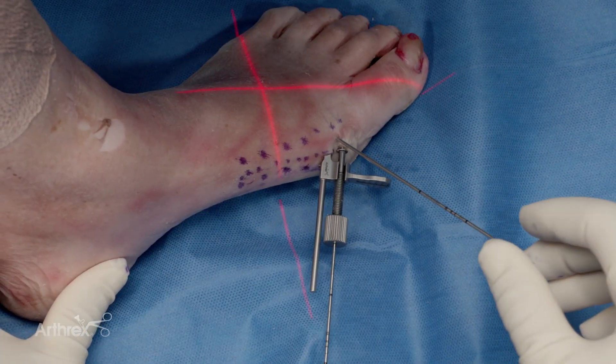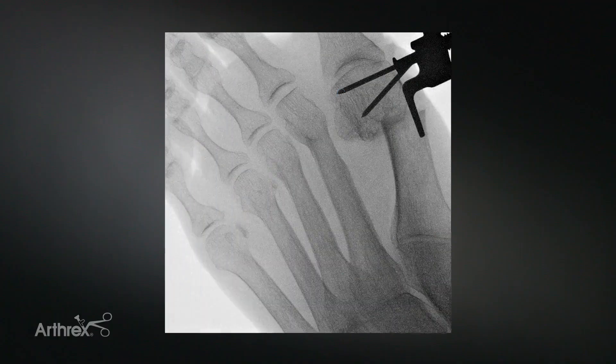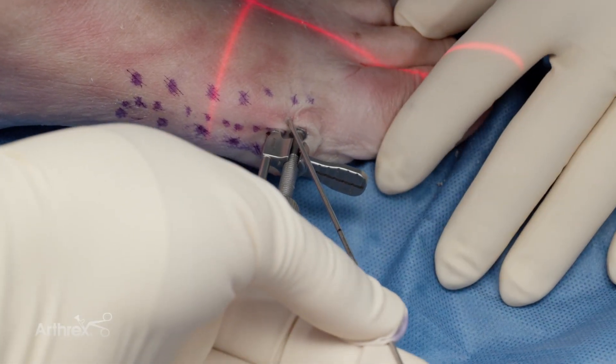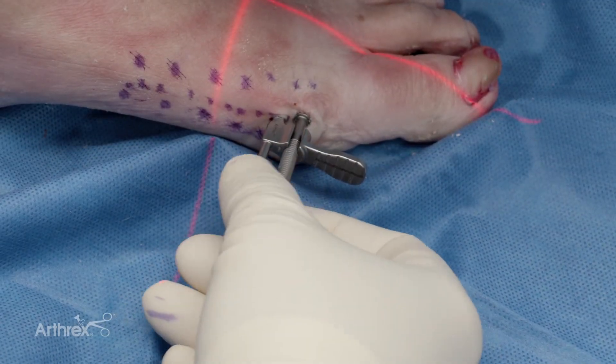If you need another point of fixation or really want to supinate the toe, you can put another wire off-axis and simply supinate the toe. This can help with sesamoid correction, ideally positioning it right to the lateral part of the metatarsal head. You can then take that other wire out if you're happy with your position — that's just an optional step for toes with a little more supination. Then we can start shifting the metatarsal.